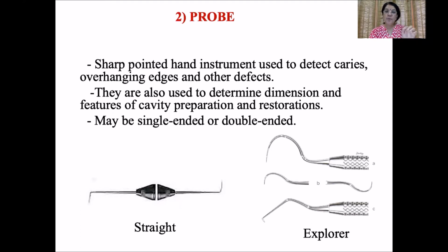So when you move the probe along the surface, you will get a sensation called the tactile sensation. And tactile sensation, if there is an obstruction, you will feel that obstruction on your fingertip, even if you don't see it. So what is this tactile sensation?